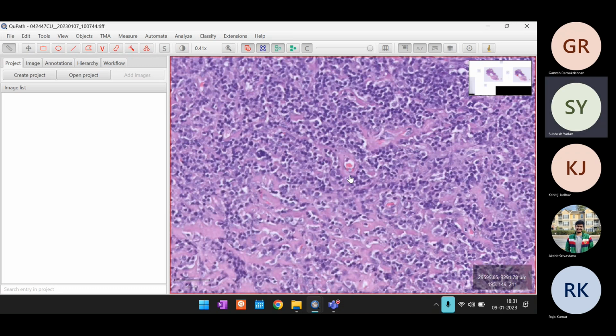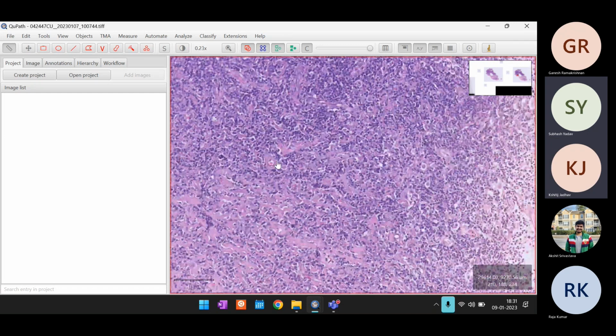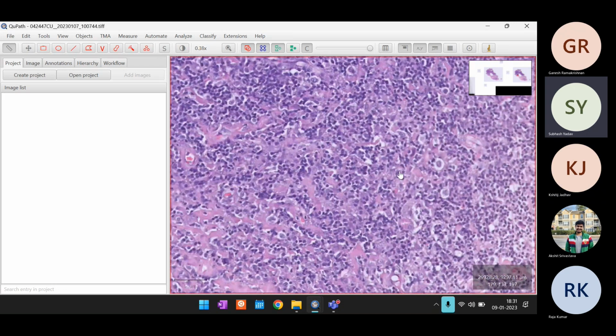I can't make out the image, but I think at your level you can see it. There are a lot of large cells in these areas compared to the background. The problem is, because you're so trained at it, it might look very easy for you, but it is not for us. I'm just saying the cells which have a clearing around it.